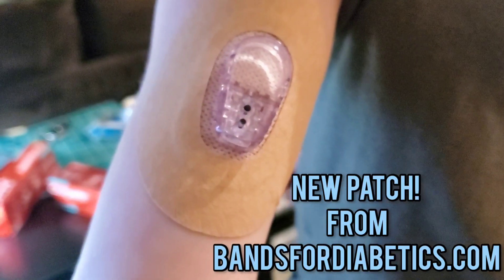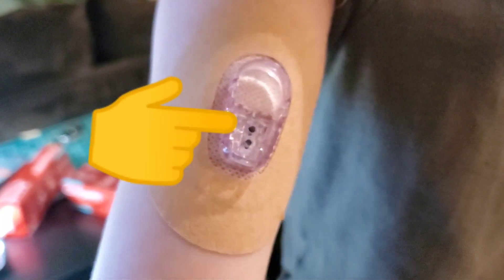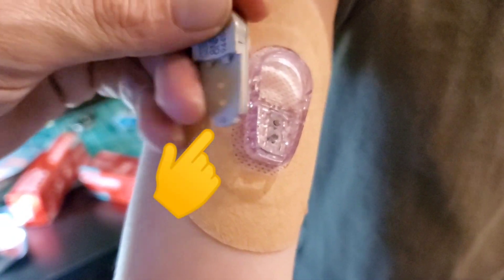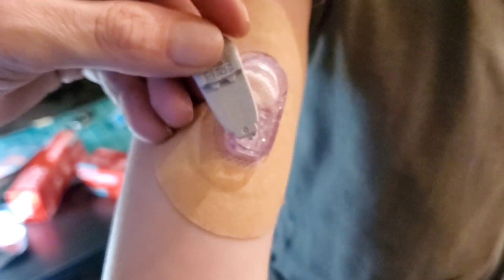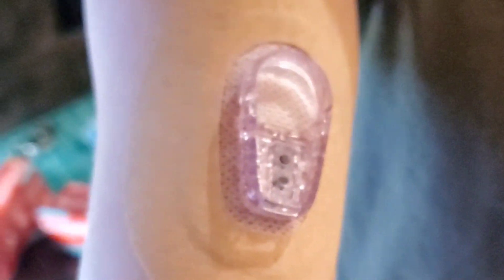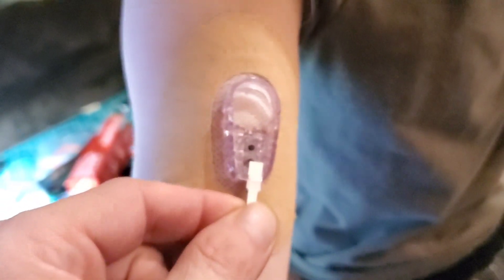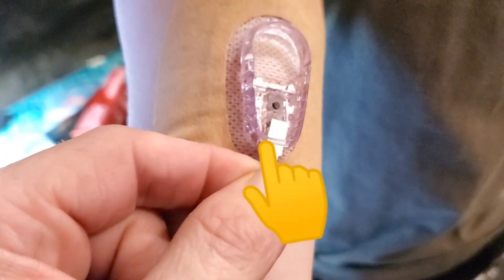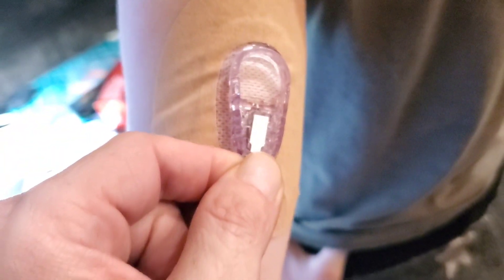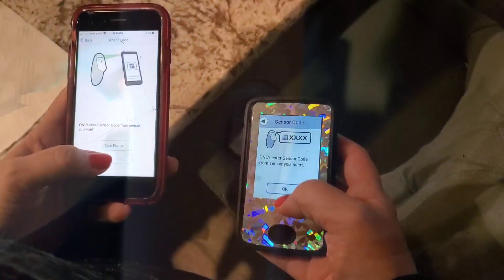This is the inside of the transmitter. Do you see these two black pieces here? These are the contacts that make contact with the transmitter — kind of like a new kid's toy with a little plastic piece inside. The goal is to disrupt the communication between these two filaments on both sides, and that is where the strip comes into play. It slides up this little doorway — there's like a little doorway right here — and the wider the strip the better, guiding it right up. When it covers it, 20 to 25 minutes, then you pull it out and recycle.